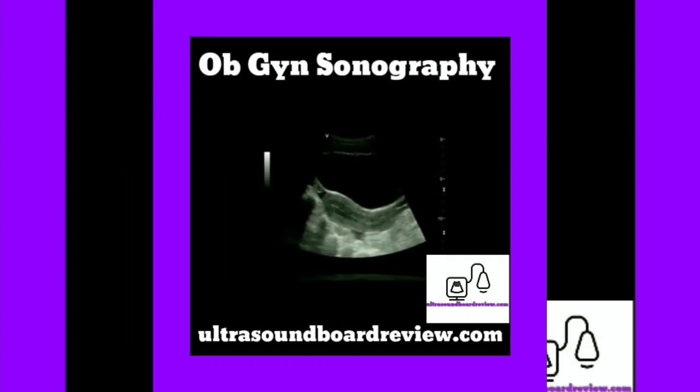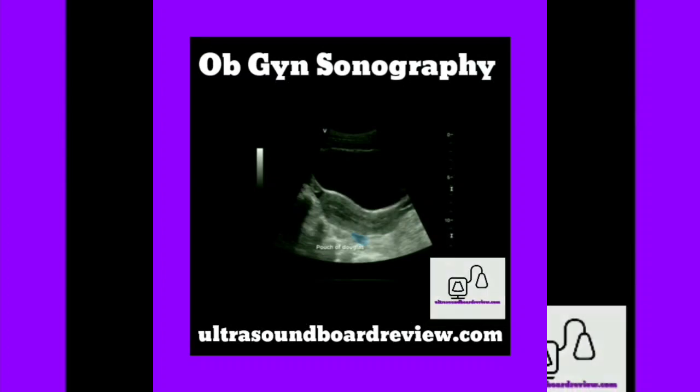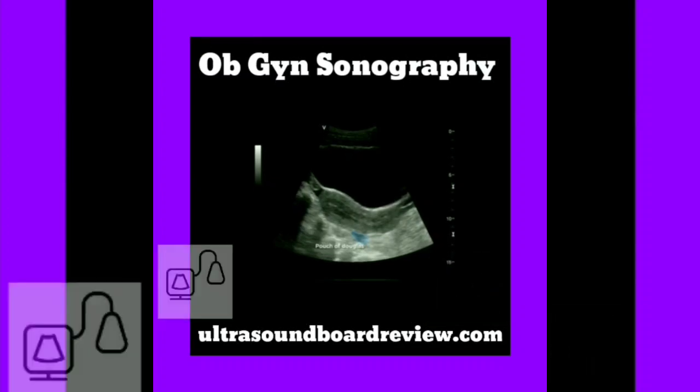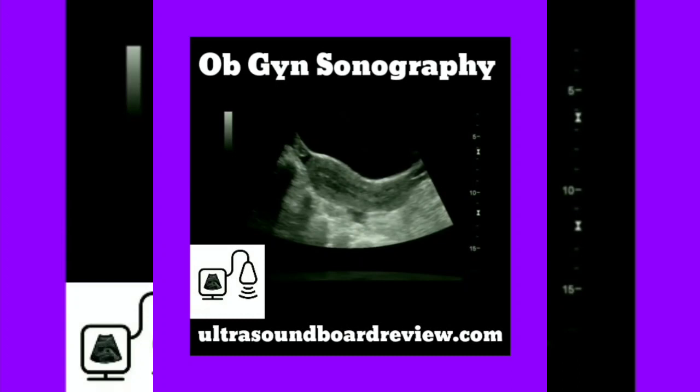In this mid-long axis view, note the location of the bladder, uterus, cervix, vaginal stripe, and the pouch of Douglas. The pouch of Douglas is a potential space between the uterus and the rectum. It is not uncommon for a small amount of anechoic fluid to be seen in this region. However, the presence of fluid can also be a sign of pathology.